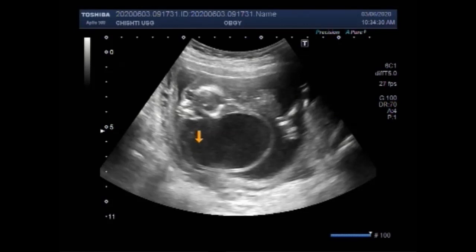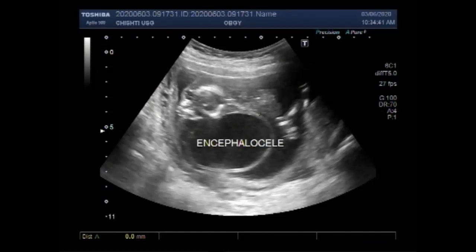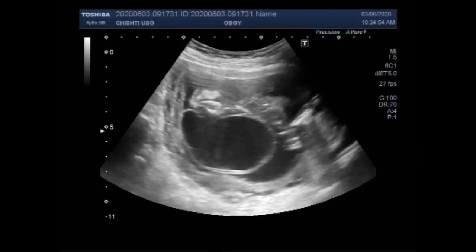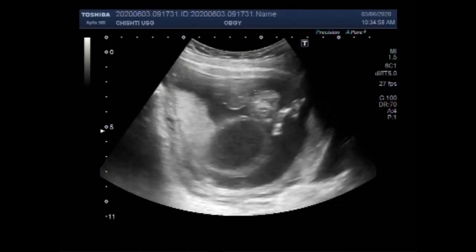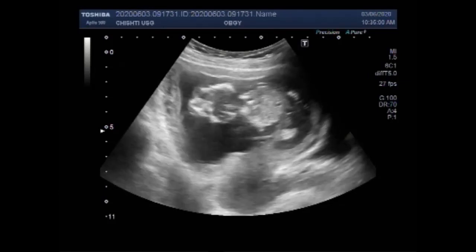Now you can see a large encephalocele attached to the fetal head side. This encephalocele measures more than 5 cm anteroposteriorly; the longitudinal as well as vertical diameter is also more than 5 cm.